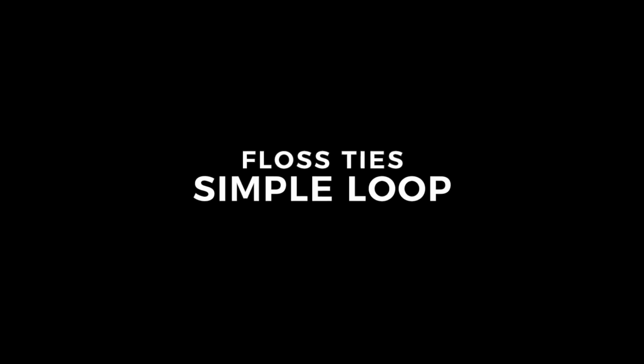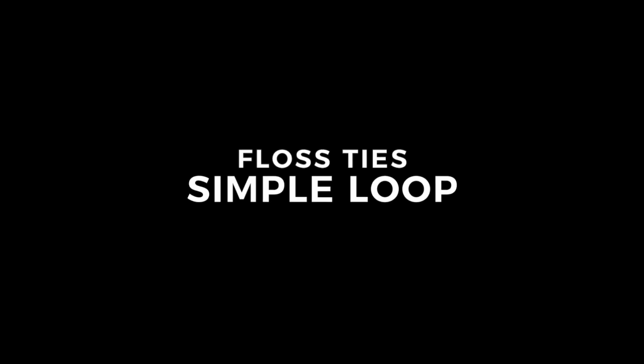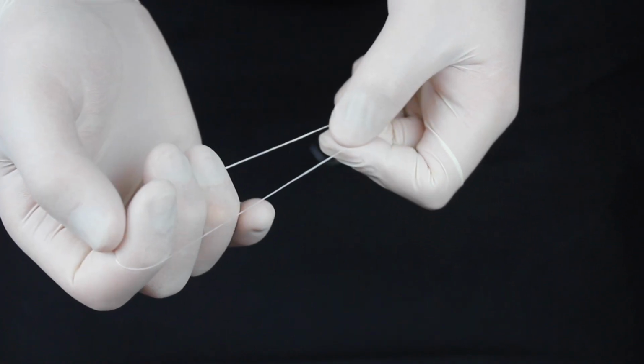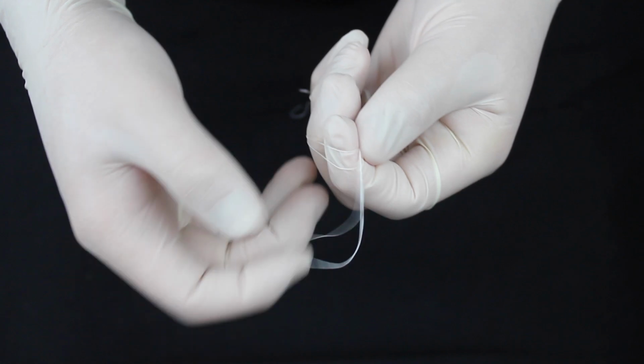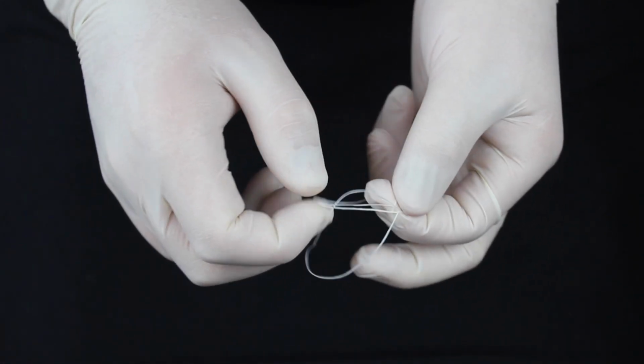There are a couple ways to tie floss. I will show you two knots. The first one is a simple loop. Fold a long piece of floss in half. Tie the loop around your fingers and simply place the loop through.